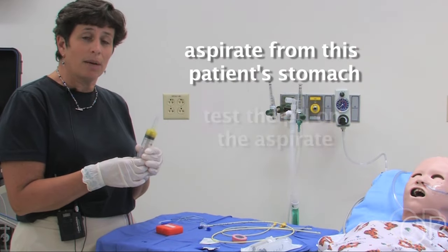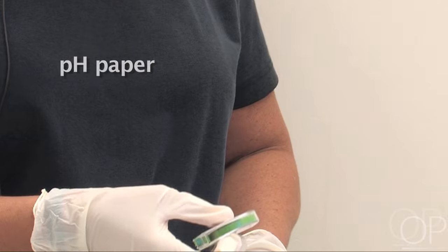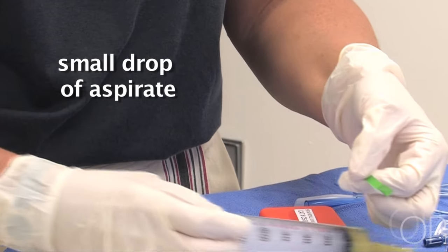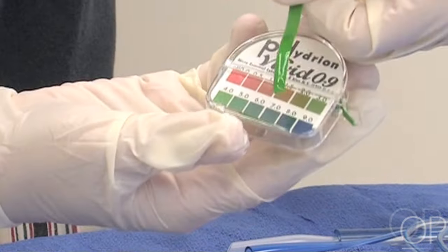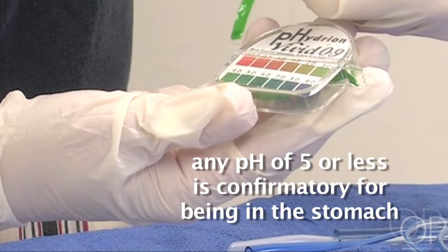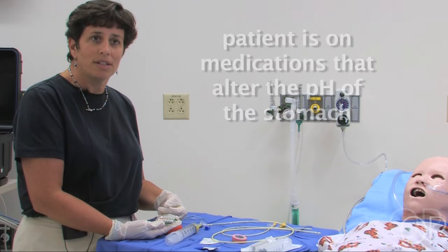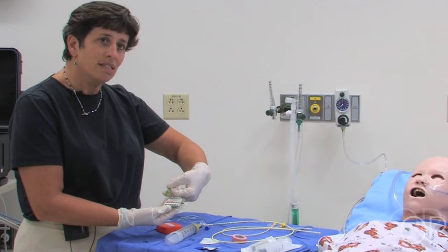I've obtained an aspirate from this patient's stomach and I'm going to test the pH on it now. I'm going to use pH paper that's been housed inside an airtight container. I'll take a small piece of the paper and put a small drop of aspirate on it. You can read the results immediately. You can see that the pH of this aspirate is four. Any pH of five or less is confirmatory for being in the stomach. If the pH is greater than five, it may be that the patient is on medications that alter the pH of the stomach, so you will need to use a secondary method to confirm placement prior to using the tube. In this case, the patient's tube is in place and we're all set to use it.